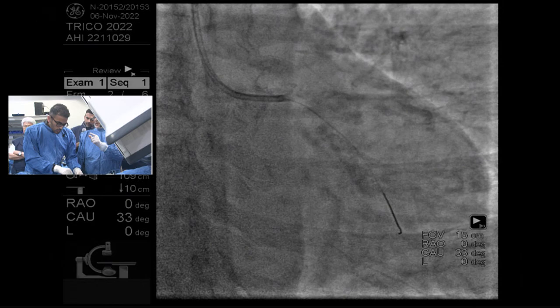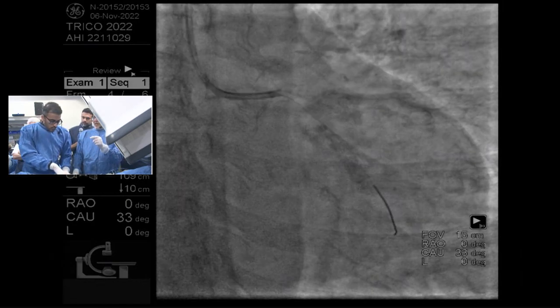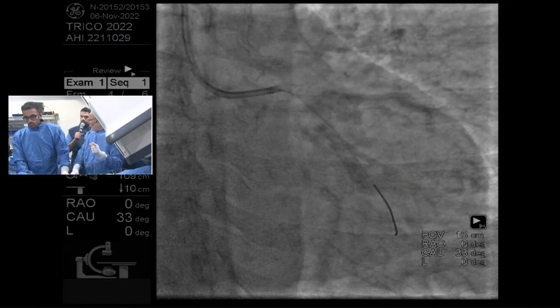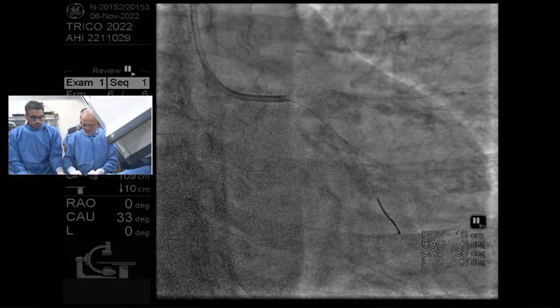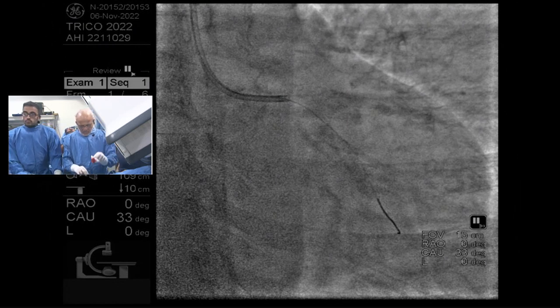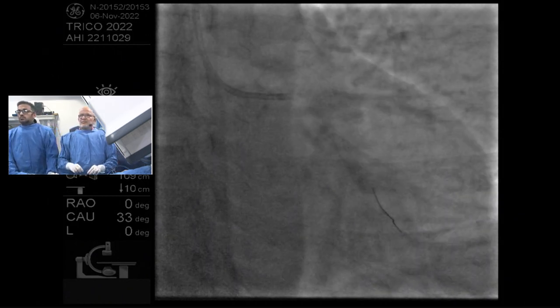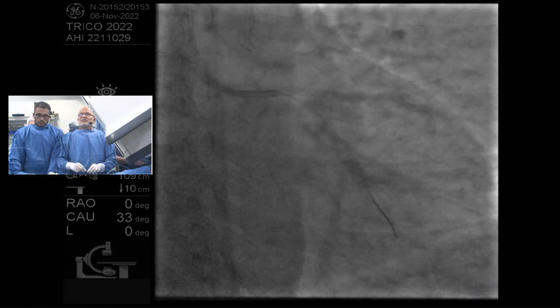So before we start IVUSing the artery from circ to left main, I'll pull my guide back, right? So what you do is deliver your IVUS first, yeah. Then pull your guide back, and then slowly pull your IVUS, or slowly do a pullback on the IVUS. But the key is, remember, you have an undilated lesion in the circ. Yeah. So when you deliver into the circ, which is why I would have put the wire in the LAD, when you deliver in the circ, you just have to be careful not to go too far because you don't want to adversely impact that lesion.